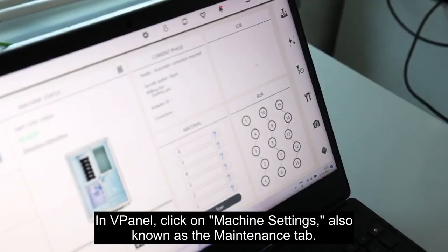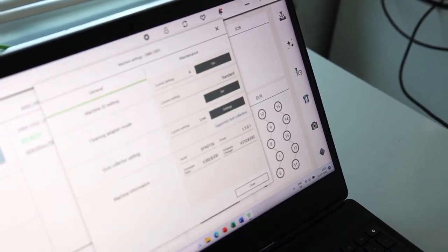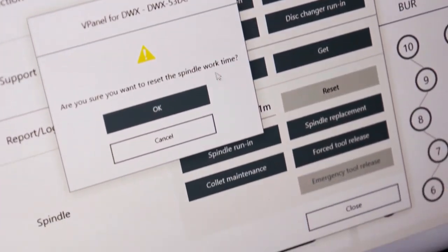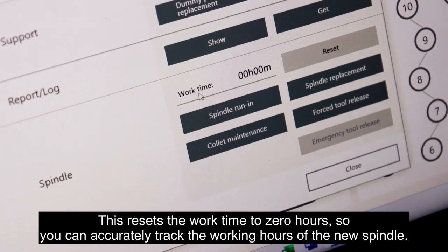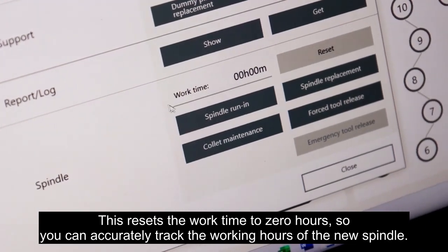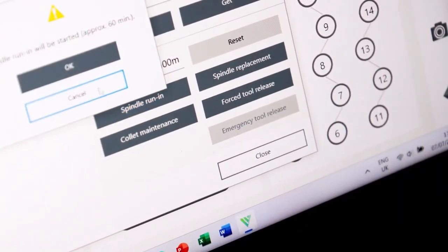In vPanel, click on Machine Settings, also known as the Maintenance tab. Then click on Maintenance, then Reset, then OK. This resets the work time to 0 hours, so you can accurately track the working hours of the new spindle. Next, click on Spindle Run-In, then OK.